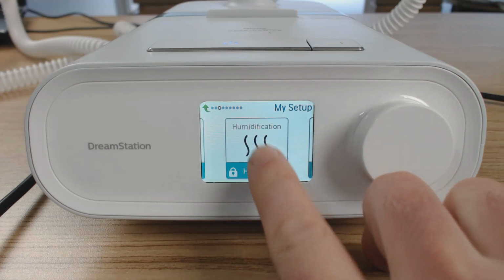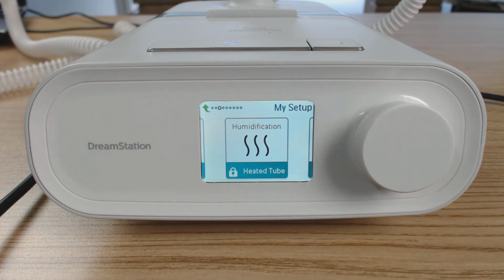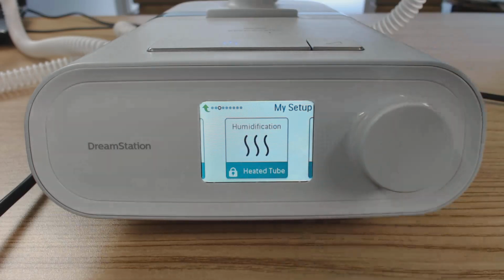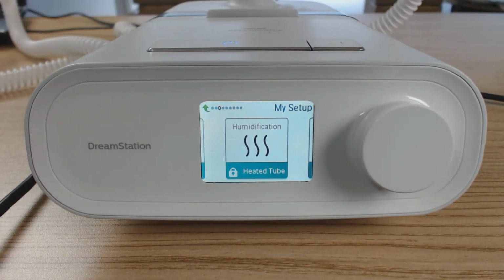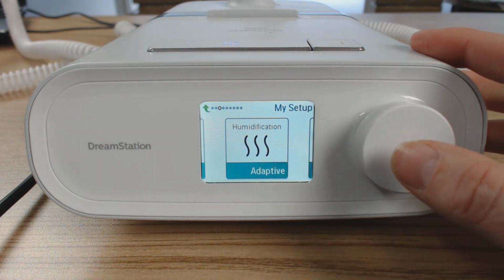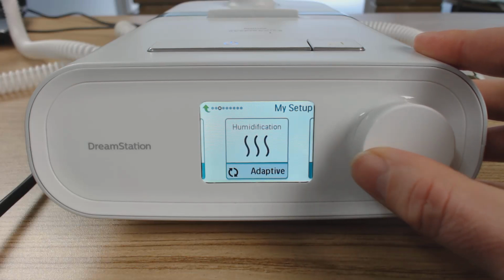Now, this says here, humidification heated tube locked, okay? Because we're using a heated tube system, that actually locks. If we're not using a heated tube system, I'll just take that out. I recommend we use heated tube, but if we don't, it gives us the ability of adaptive or fixed, okay? So they're the two options, adaptive or fixed.